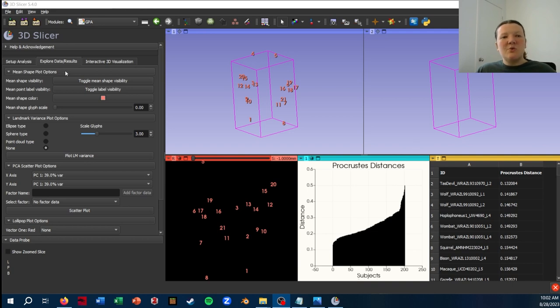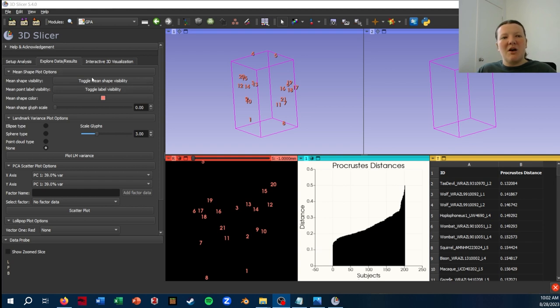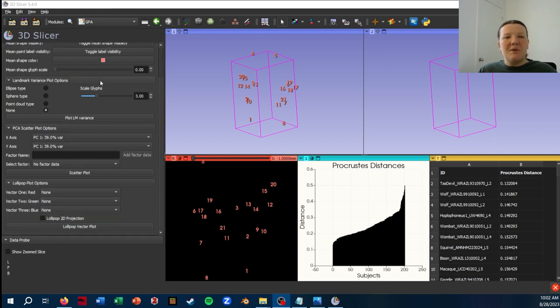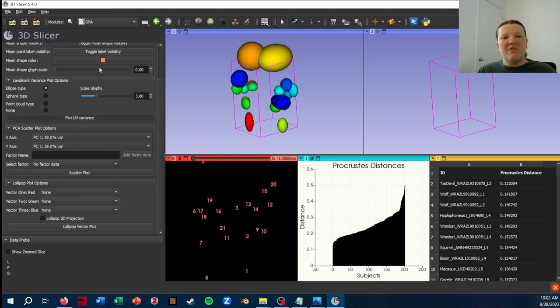Okay, so this Explore Data / Results tab has a few different useful options. The mean shape is displayed by default when you run your GPA, but you have some options that you can play around with to change how it's displayed. Next we have a landmark variance plot option. So I'll just show that very quickly by selecting the ellipse type and clicking Plot LM Variance.